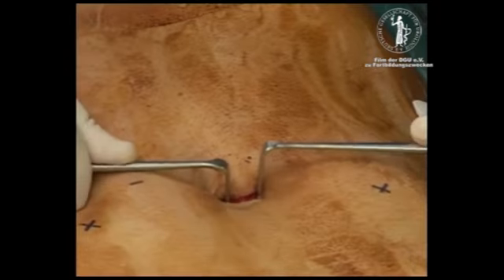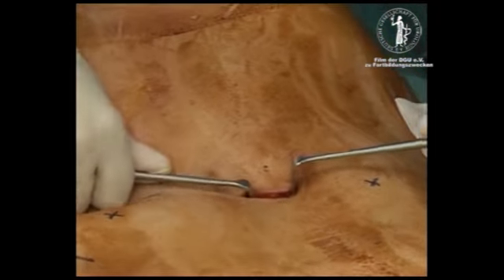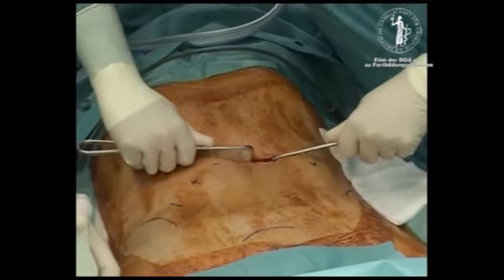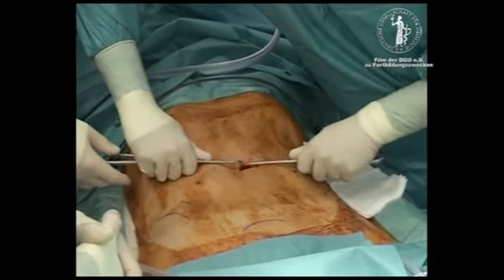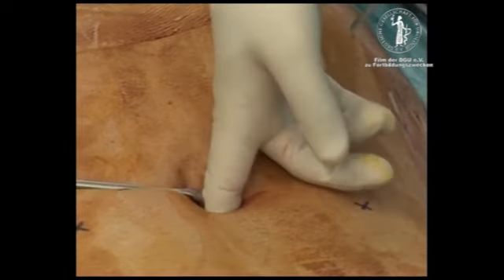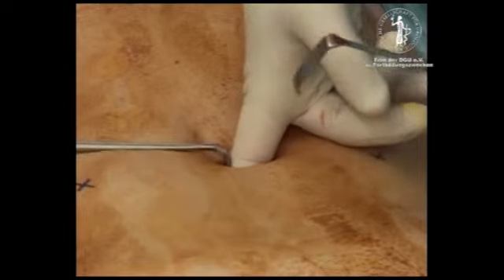The 2 Langenbecks divide the rectus muscle and expose the posterior layer of the rectus sheet. The preperitoneal space is then freed by blunt finger dissection.